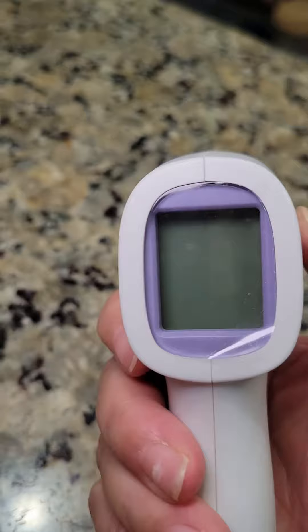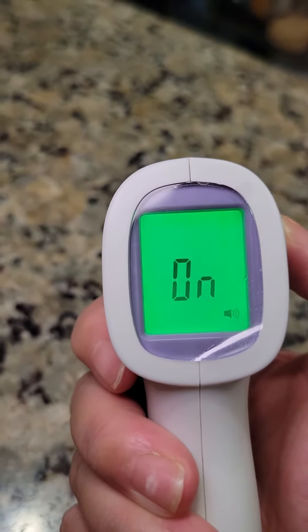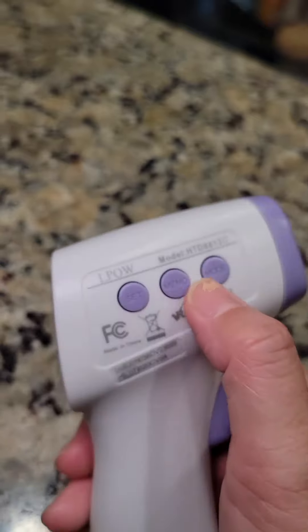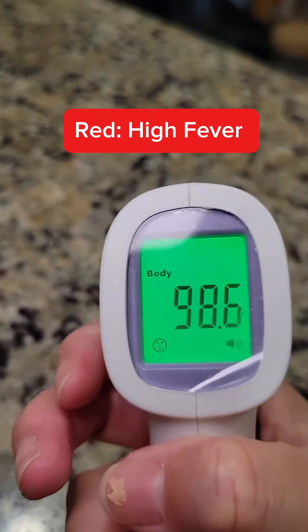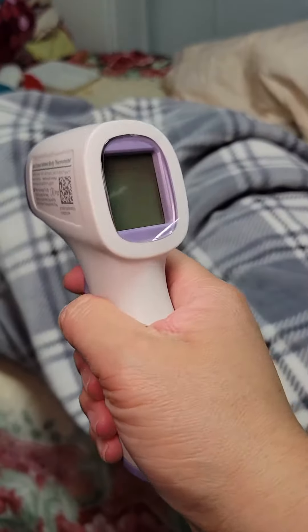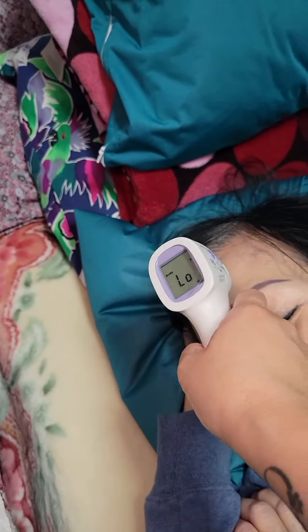One more check on her body and everything pans out green — no fever, which is great news. A few reasons why I like and recommend this product: it's fast, it's accurate, and it's no-contact measuring. There are three backlight indicators — green for no fever, yellow for mid-range, and red for high fever — and it will alarm for any high fever readings.